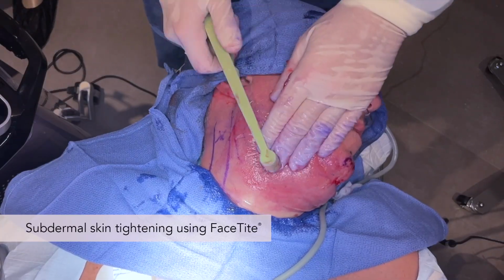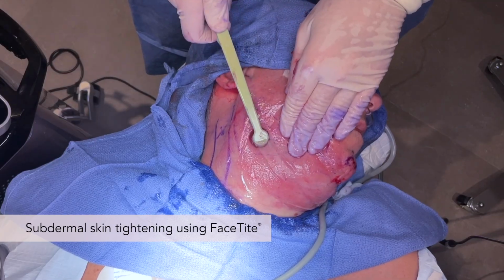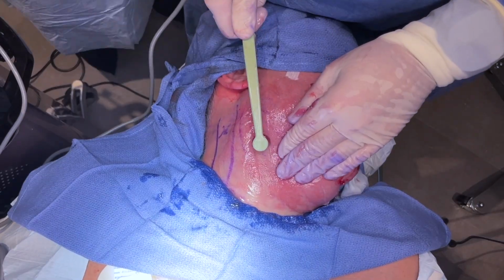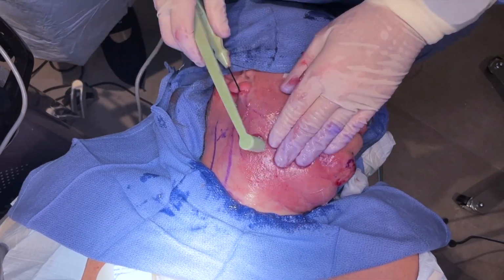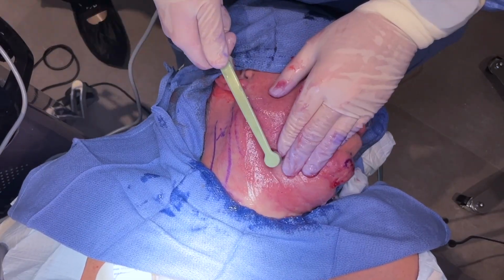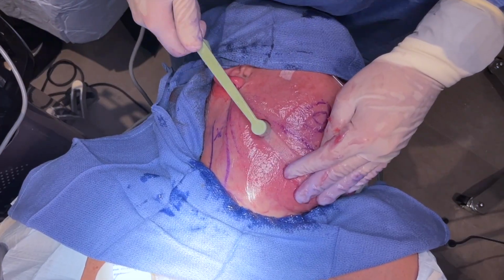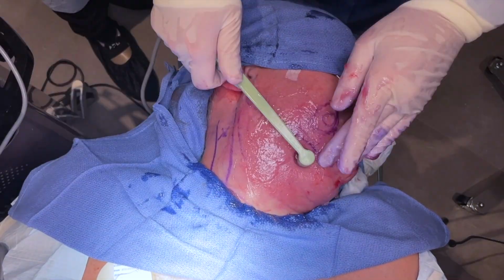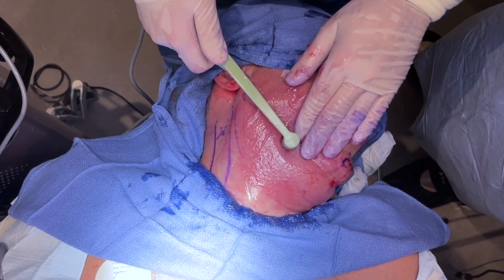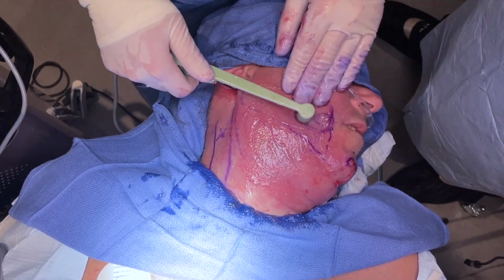We inserted the probe. It has an external temperature and an internal temperature, and you can set it. For instance, one of the common internal temperatures is about 64, 65, and in the body you can definitely go a little bit higher. In the face, we don't really like to go more than 65. And the external temperature, usually we're trying to keep it around 38, 39, depending on the patient, depending on the thickness of the skin.